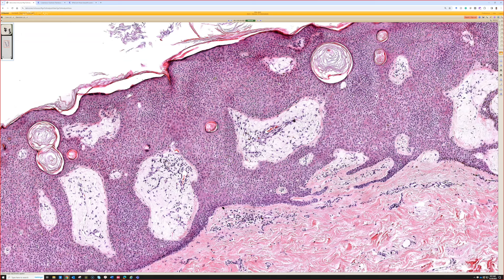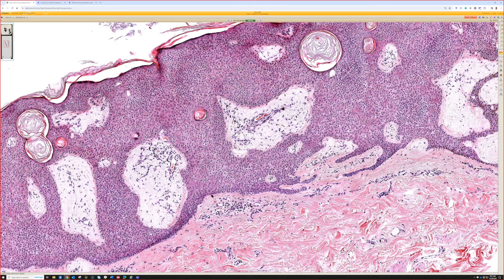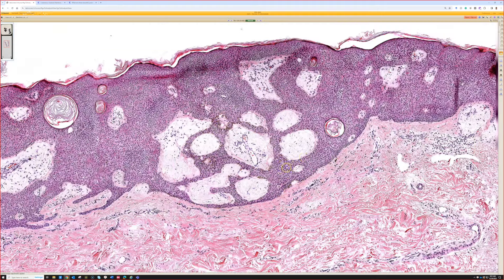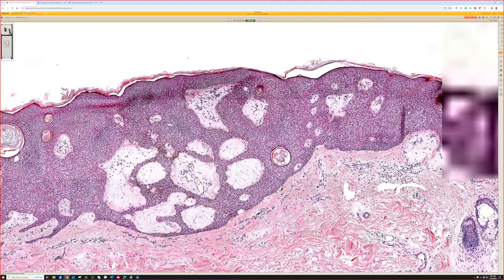This is incidental keratin amyloid. When I encounter this, I personally do not mention it in my pathology report, to minimize the chance that someone reads it and gets concerned that the patient needs a bone marrow biopsy or SPEP and UPEP to rule out myeloma or systemic amyloid. It doesn't mean anything — it's an incidental finding. I teach about it so that you, as a pathologist, recognize it: yes, it's amyloid, but no, it is not light chain — it's keratin-derived material, just an incidental finding with seborrheic keratoses, basal cells, and other tumors.